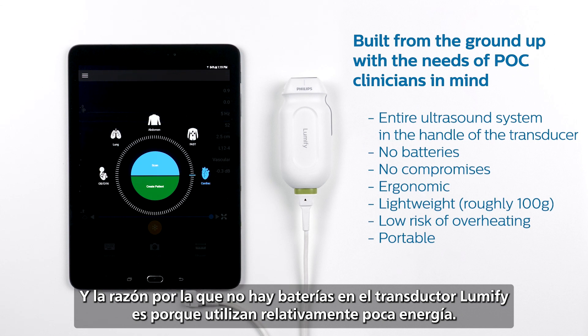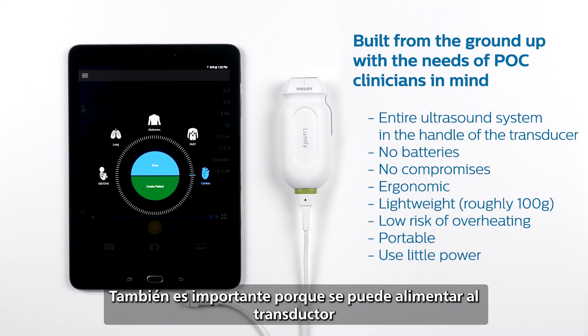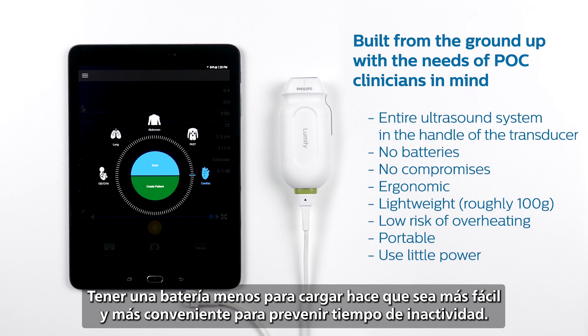The reason there are no batteries in the Lumify transducer is because they use relatively little power. That is important because it means your system and your transducer are at a low risk of overheating. It's also important because we can power the transducer using the compatible device it is connected to — so you don't have to worry about keeping both your device and your transducer charged. Having one less battery to charge makes it easier and more convenient to prevent downtime.